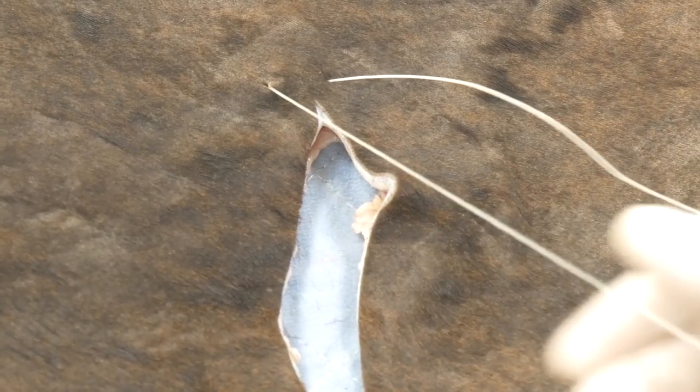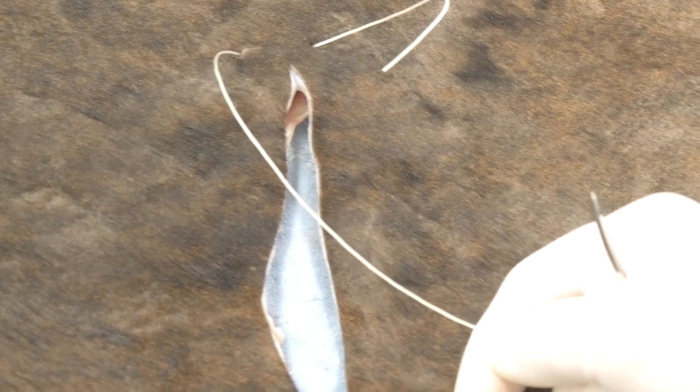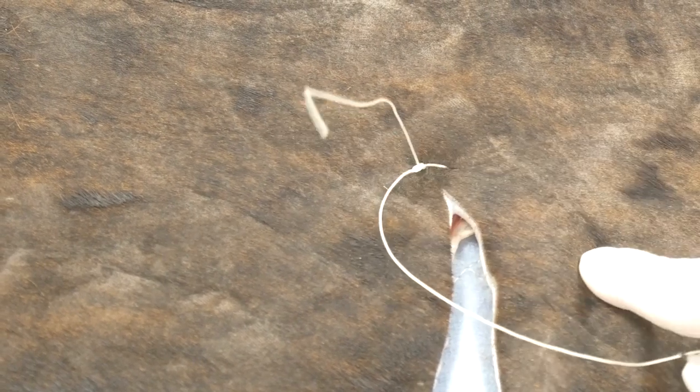Now we can pull the bulk of the suture up. Since we don't have needle holders in our hands, this is a great time to do a hand tie — either one-handed or two-handed. We want to tie four throws, and now we've got a knot tied just dorsal to where our incision begins.